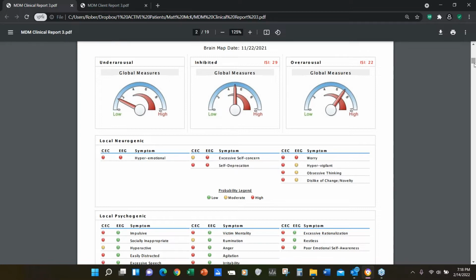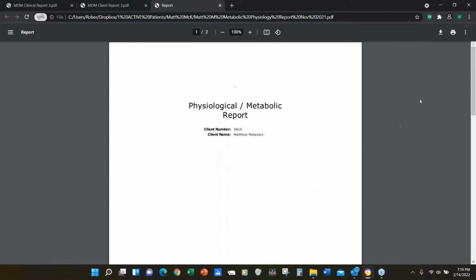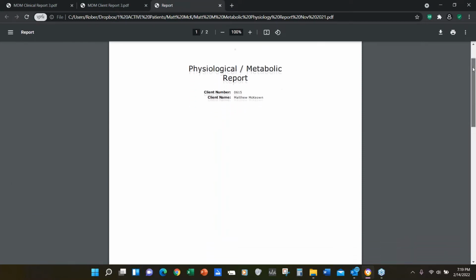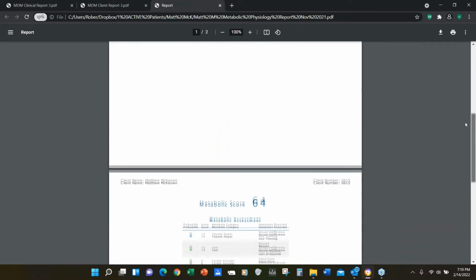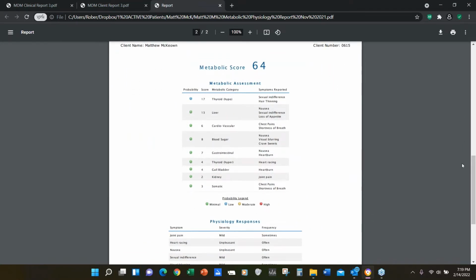And the way I conceptualize this, which I'm hoping is right, I say these all are indicative of a scoring. If you notice in here, you may see, let's see, do we have a couple that are repeaters? Because they're often repeaters, and I try to explain that. Heart racing, and this one has nausea a couple of times.